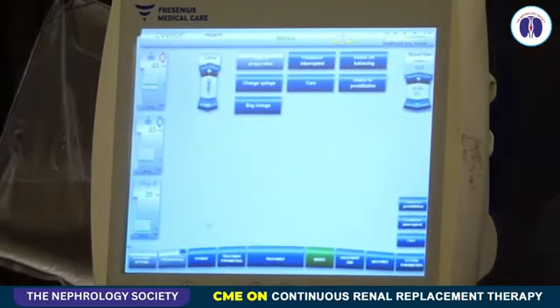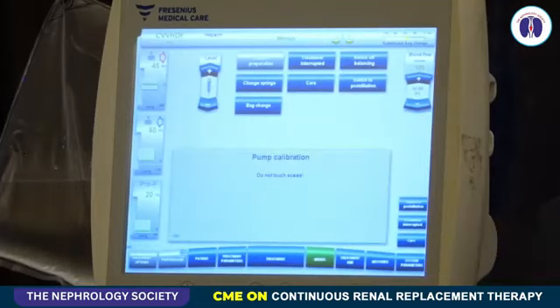And the bags can be reutilized, like sometimes we are changing from 2K to 0K, and there is a partially utilized bag, and it can be reapplied, right? Yes, you can do it. There are 2 ways. One, the best approach is, if you want to use 0 to 2K of solution, let the 0K solution empty first, and then you can put another 2K of solution.